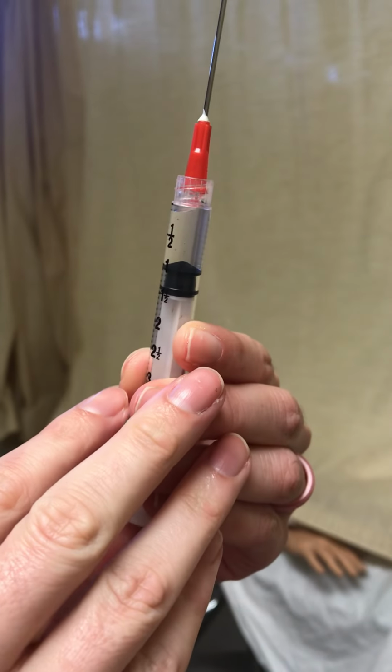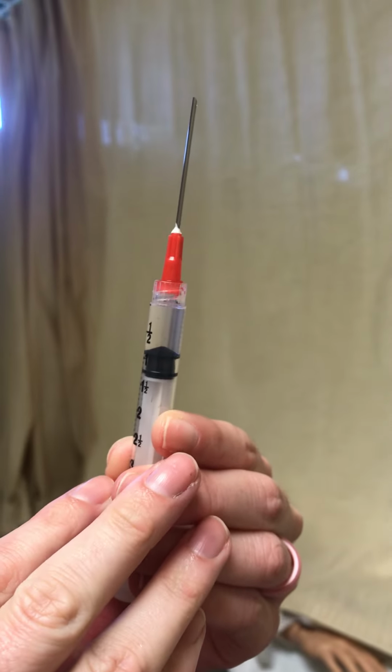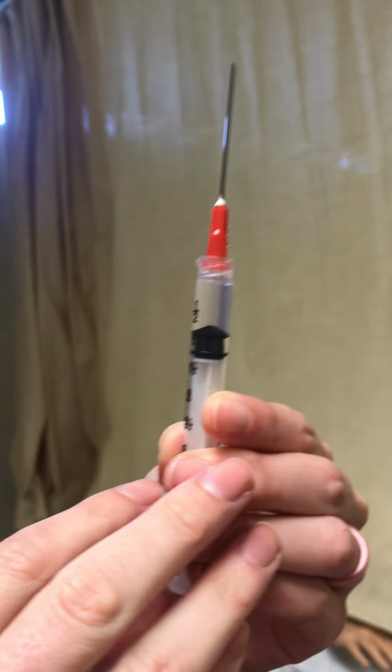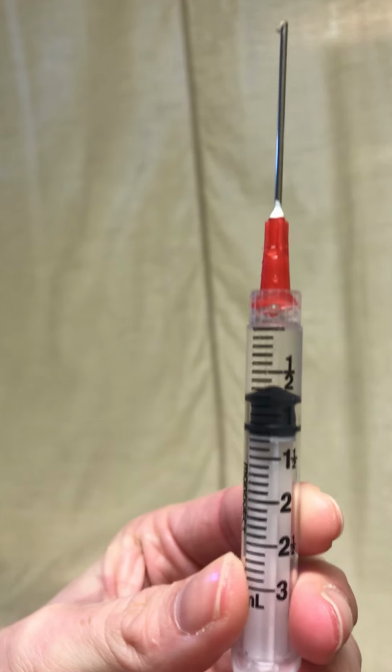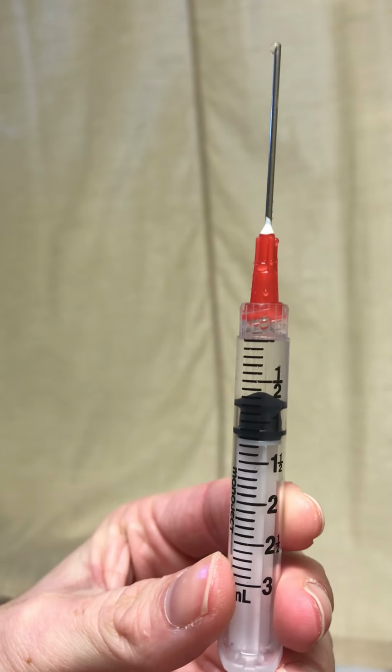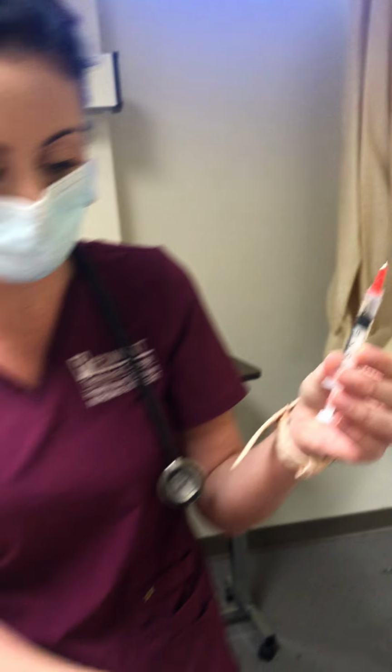Okay, and I'm going to make sure that there's no air bubbles and prime the syringe. Okay, and I have 0.8 milliliters of methylprednisolone.